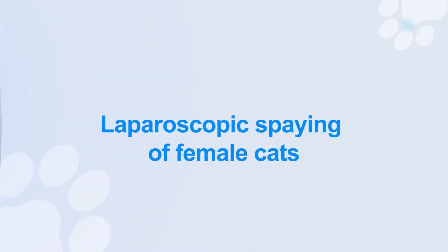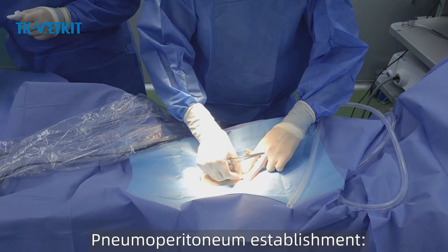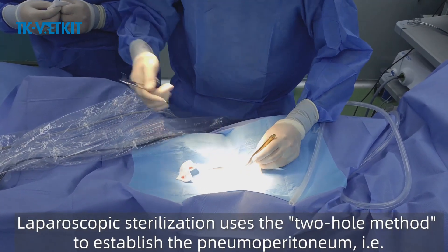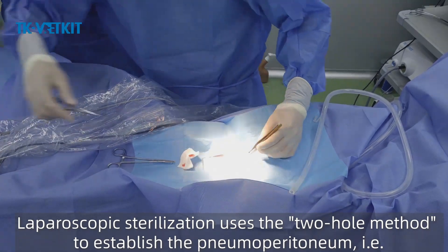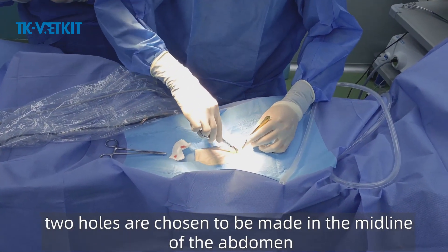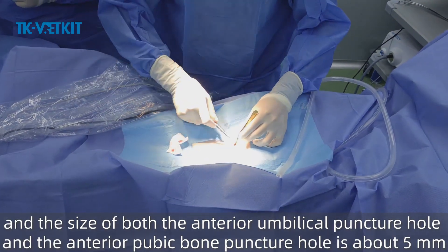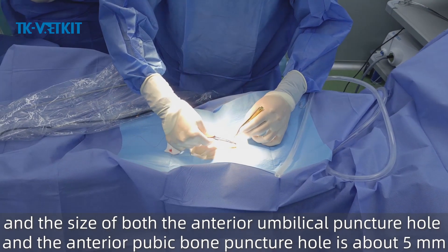Laparoscopic spaying of female cats. Pneumoperitoneum establishment. Laparoscopic sterilization uses the two-hole method to establish the pneumoperitoneum — two holes are chosen in the midline of the abdomen, and the size of both the anterior umbilical puncture hole and the anterior pubic bone puncture hole is about 5 mm.